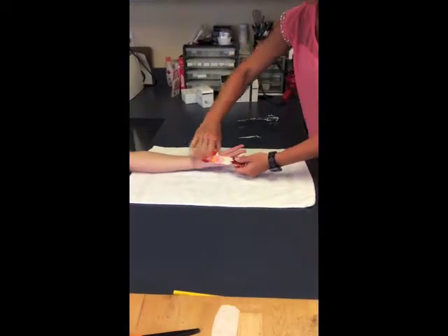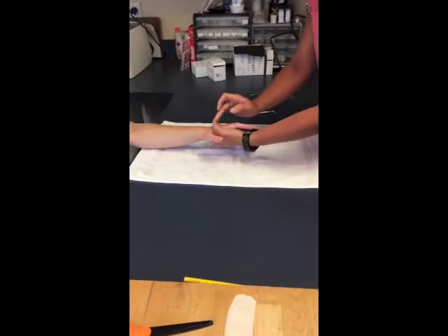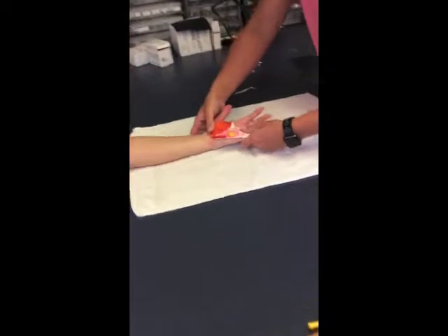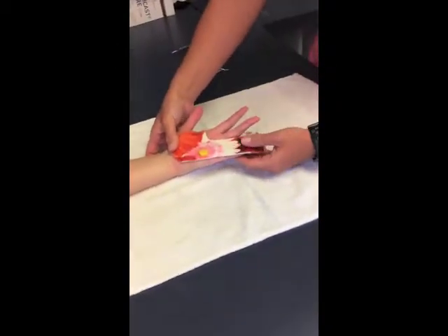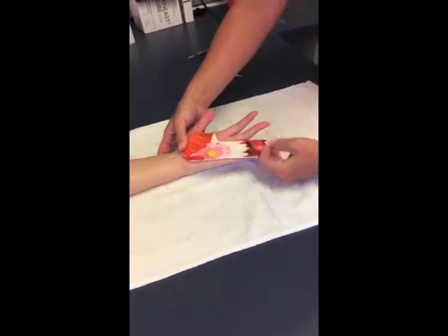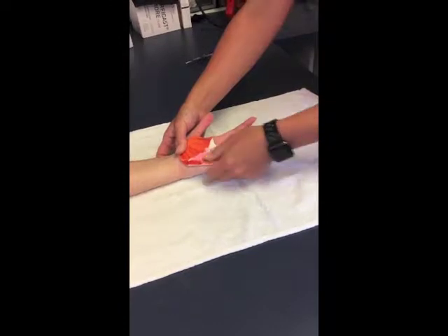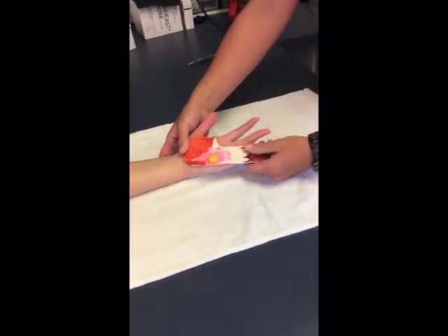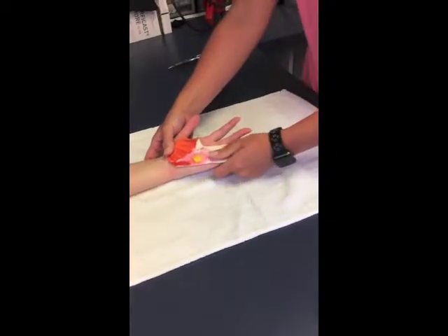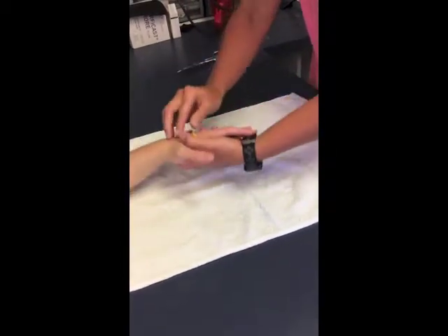I made those adjustments. Now I'm pulling the thumb piece around over here to support this area. I'm putting pressure on her fourth and fifth fingers to straighten them as much as possible. They may not be able to get to zero degrees of extension, but you can make more each week to progressively get there. Now I'm just waiting for it to cool down and mold to the patient's hand.